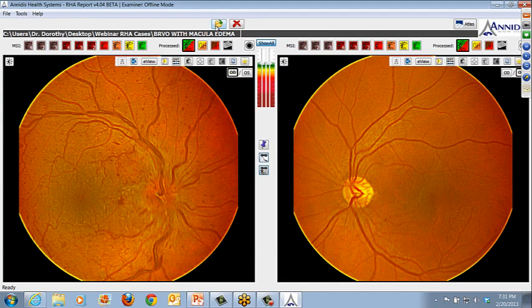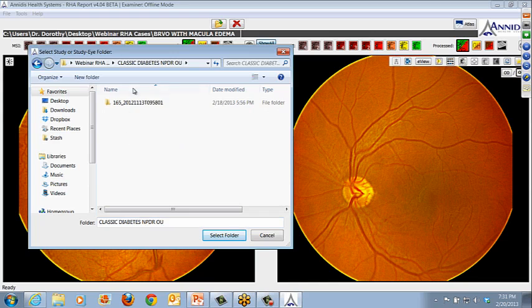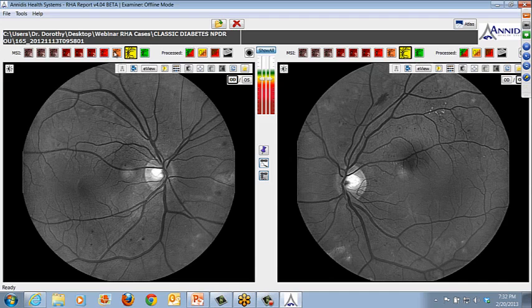Just going to move on to one case of diabetic retinopathy here. This was one from the field, so somebody might recognize this. This is a relatively classic example of a patient with diabetes, non-proliferative diabetic retinopathy. I'm just going to walk you through the different lesions that you can see here in the arcades and what you would expect to see and where they would be hyperreflective, and how you differentiate just a little bit in a patient with diabetes. So again, exudates and hemorrhages are intraretinal.